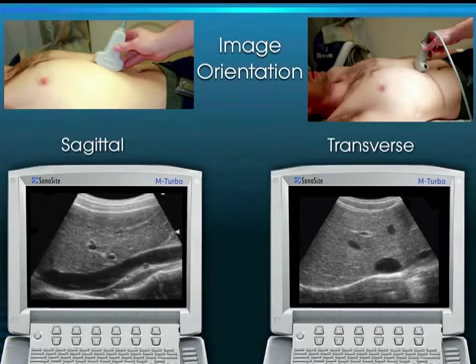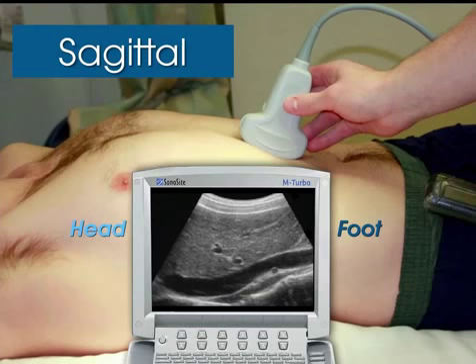And this is the transverse view. We have the indicator towards the patient's right. Same blood vessel, the IVC now seen in a short axis. And we see everything over here is towards the patient's right. Everything over here is towards the patient's left. But just to reiterate this point, this is the sagittal view. And recall that sagittal means longitudinal as approached from the anterior portion of the body. And it's a long axis of the body when we come anteriorly.